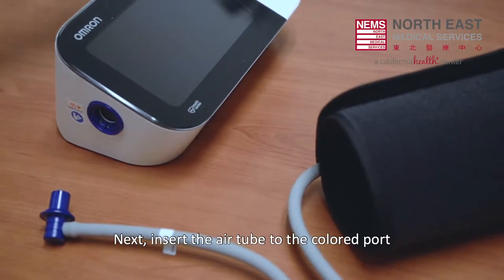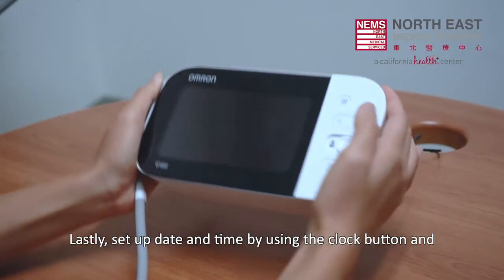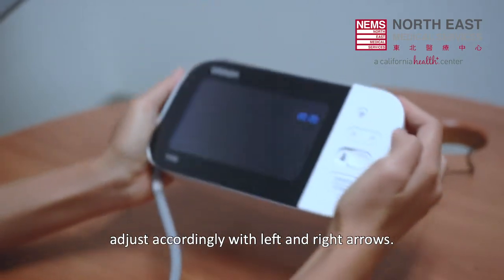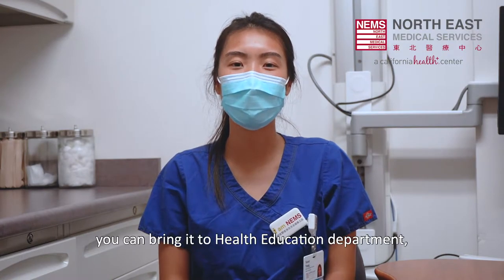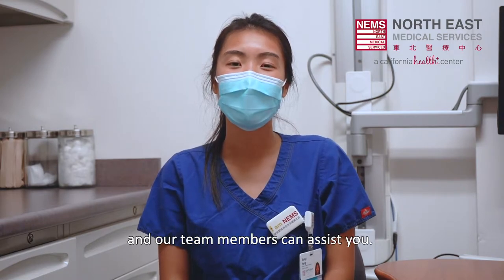Next, insert the air tube to the color port on the side of the monitor to connect the cuff. Lastly, set up the date and time by using the clock button and adjust accordingly with the left and right arrows. If you are having trouble setting up your blood pressure monitor, you can bring it to the Health Education Department and our team members can assist you.